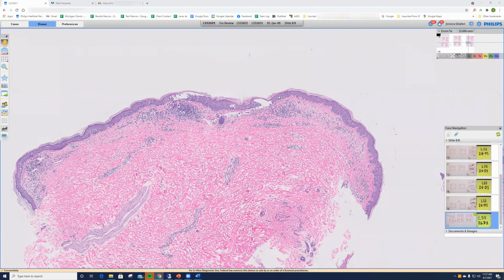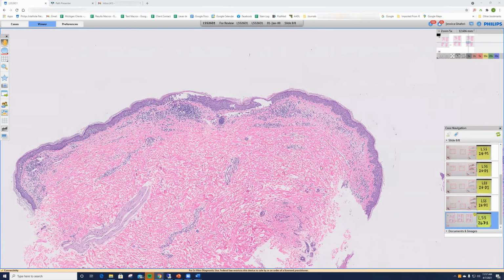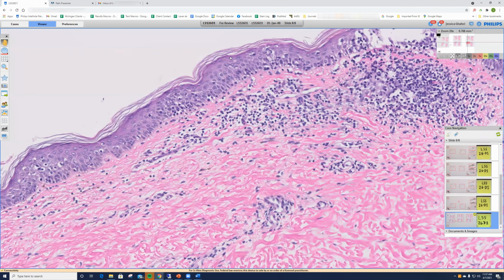But if they have patch stage disease and it's kind of a typical MF in that double covered distribution, but your biopsy is not diagnostic, then you just want to continue to follow them and treat them as if they're MF, but it's just not quite there yet with the diagnosis. Oftentimes H&E is the gold standard for diagnosis. And here we can see kind of some of those typical features where we have a normal stratum corneum, so we don't have much in the way of spongiosis.